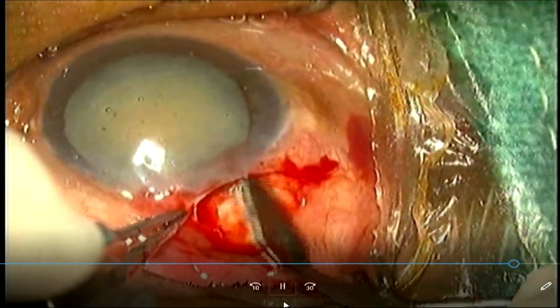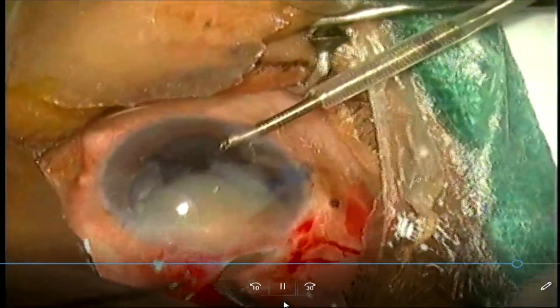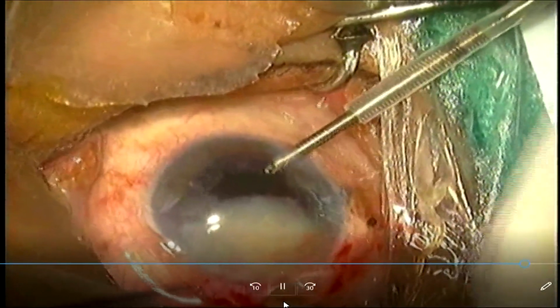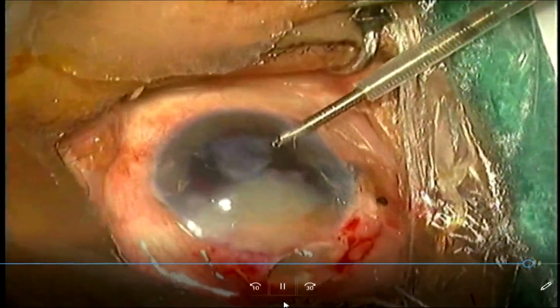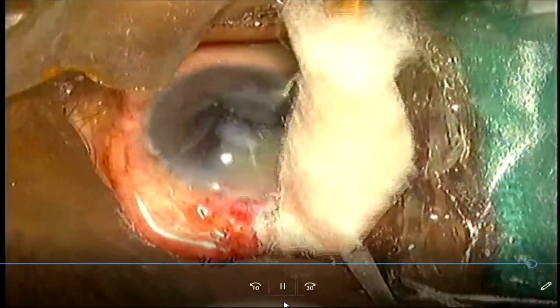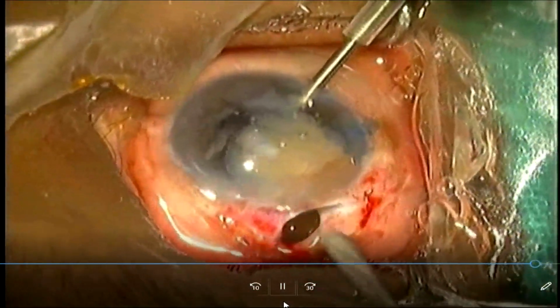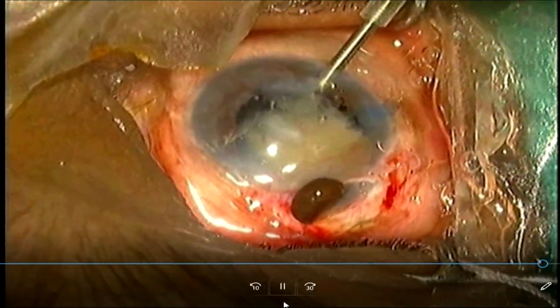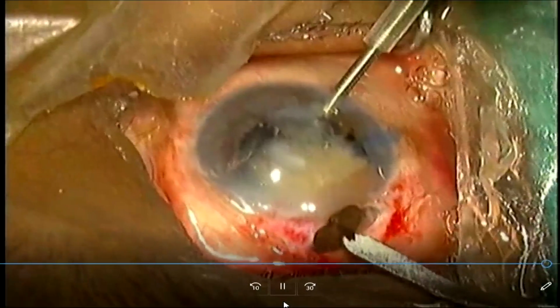Now this is another case where again there is a premature entry, and as the nucleus comes, the iris has a tendency to get incarcerated beneath the nucleus. So if your nucleus is not progressing and you have a doubt that there is a premature entry, then don't try. This is what you should not do.